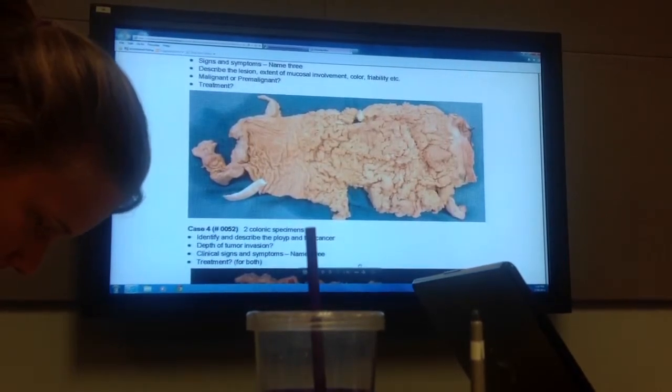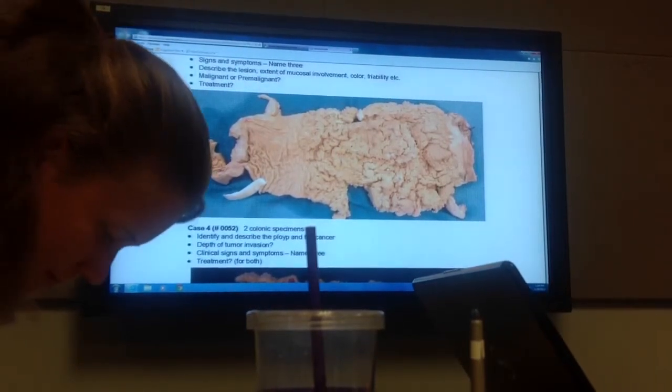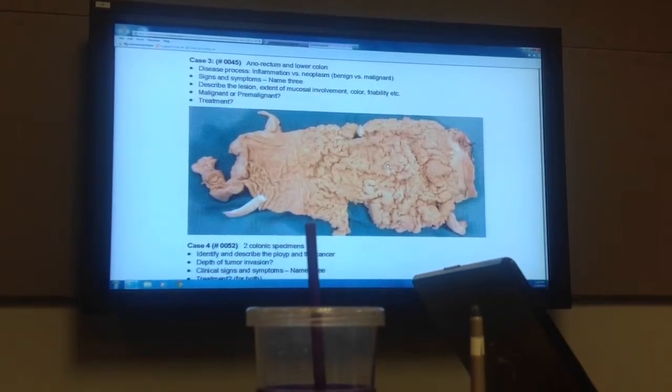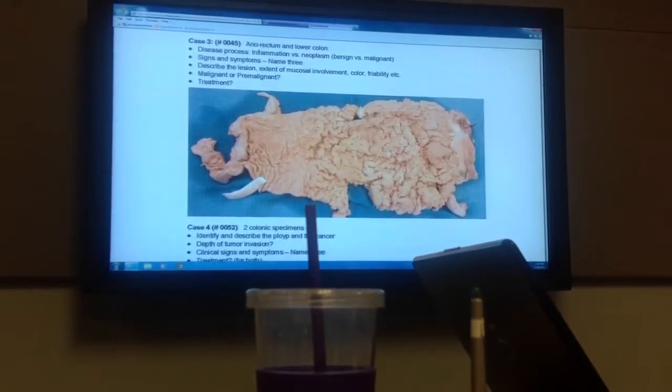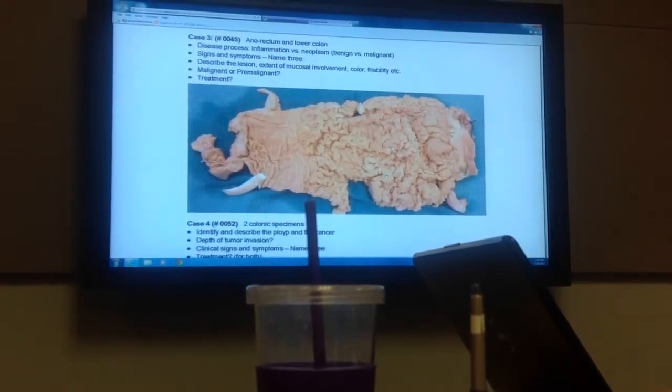If I told you that this is the lower rectum, lower colon, something that gets big and usually occurs in the very distal large bowel. Okay, I'll give you another hint. This is horrible. We just never see these anymore, but this is a big, shaggy villous adenoma.